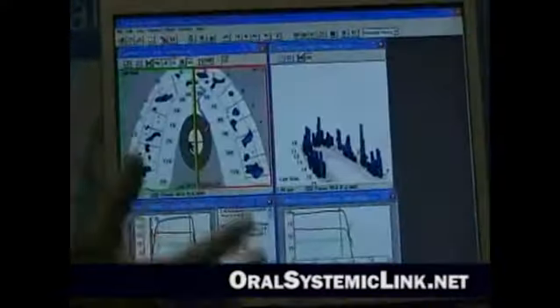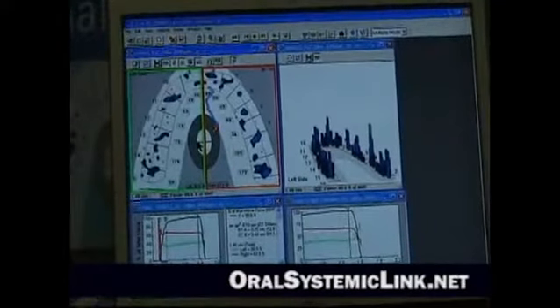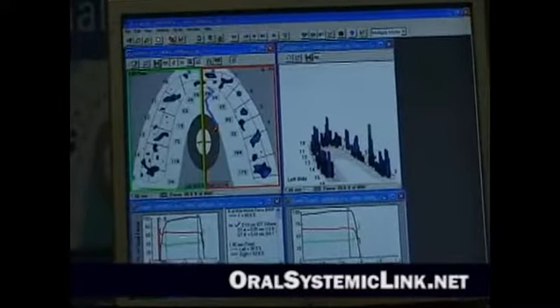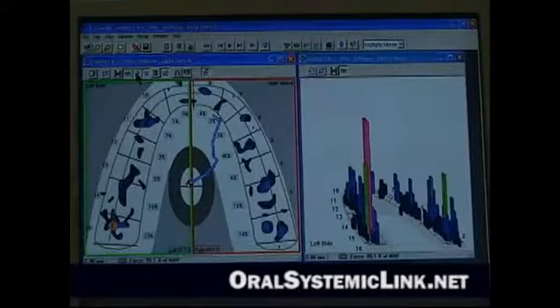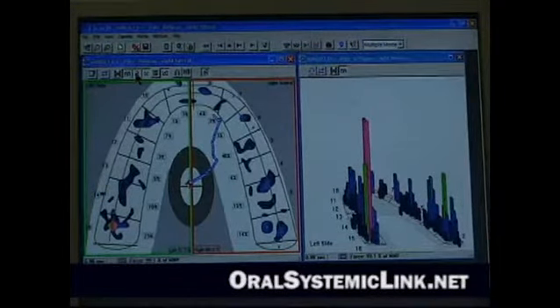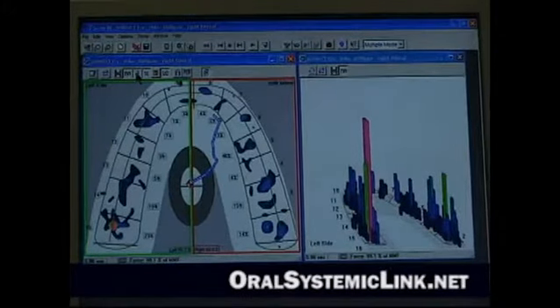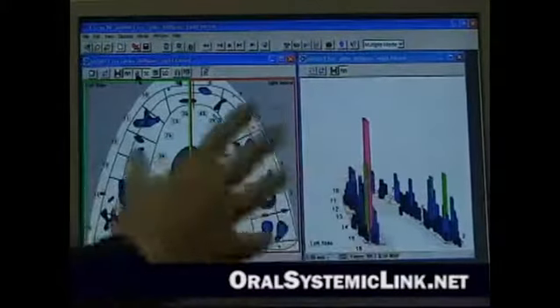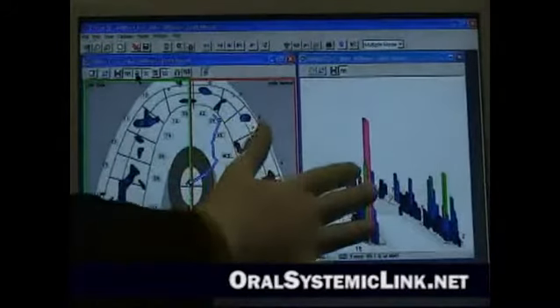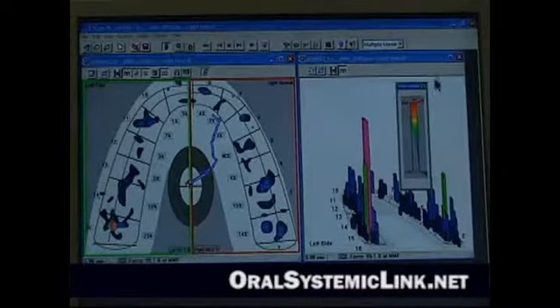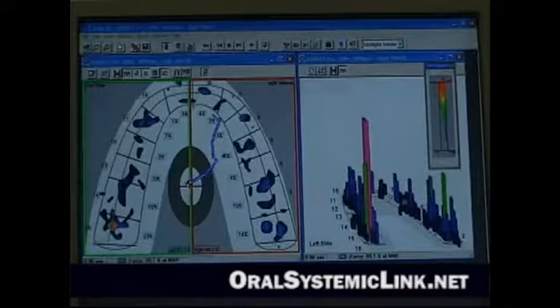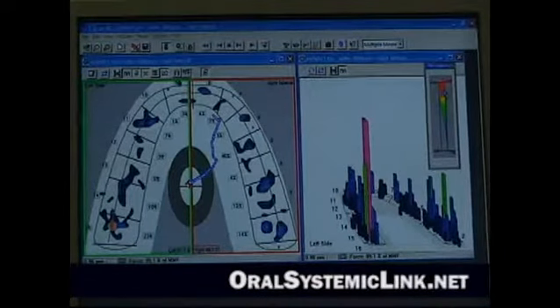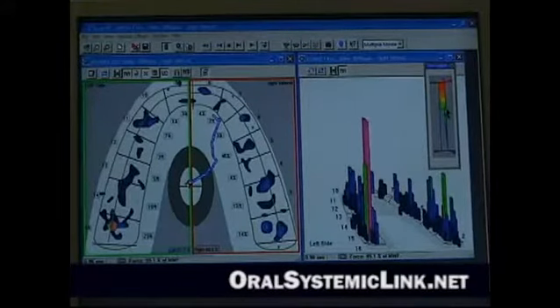So we'll look at our habitual bite to begin with. There's a lot of data on the screen, but I'll explain the basics. What we're looking at here is a three-dimensional view of the forces — the same data shown in 2D and 3D simultaneously. The taller the column and the warmer the colors, the greater the force. Low forces appear in blue, higher forces appear in red and pink, and green is a mid-range force level. We have about 13 force gradients to show.